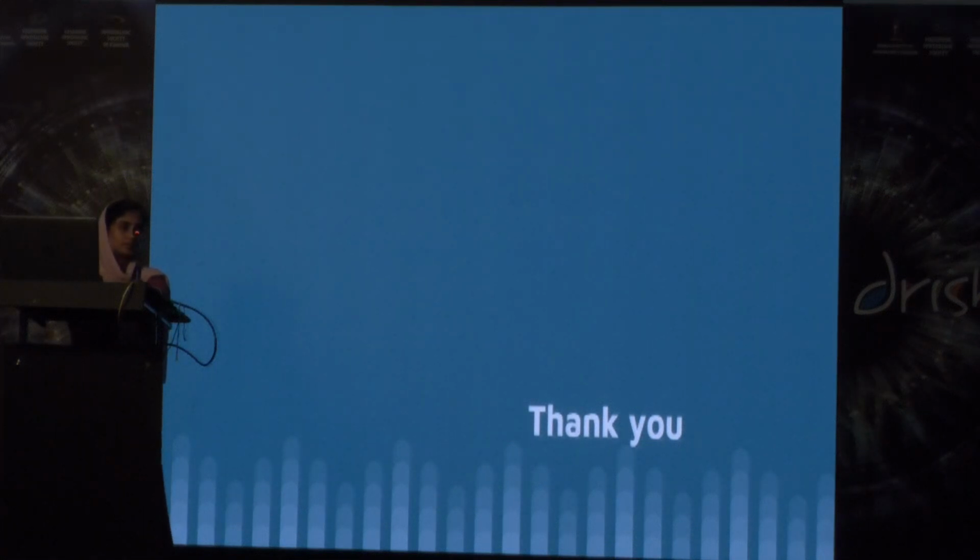Okay. What was the diameter of the lens used in all cases? Same diameter or different? In most of the cases, we ordered the semi-scleral lenses, but when the fitting is not correct for the patient, we have to move to the lens with more landing zones.